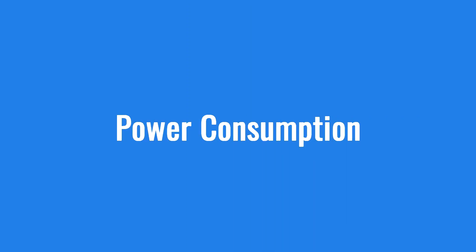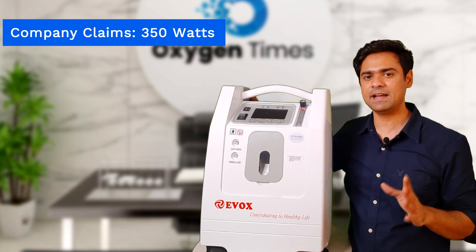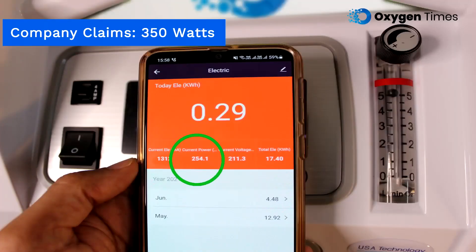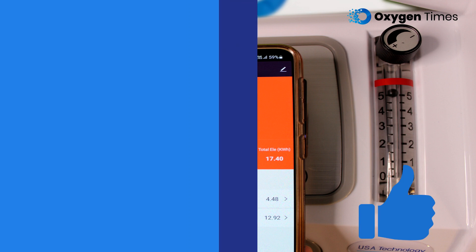Now we will test the actual power consumed by the Evox 5 LPM. The company claims it consumes around 350 watts of electricity. We checked power consumption using a smart plug by setting the flow to 5 LPM, and the results turned out to be quite impressive. Even at the highest flow rate, the concentrator is consuming only 255 watts of power. It is a thumbs up from our side when it comes to the power consumption factor for this machine.